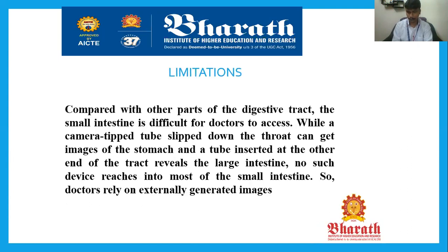Limitations. Now we are going to see the limitations of performing the endoscope. Compared with other parts of the digestive tract, the small intestine is difficult for doctors to access. You can view the internal structure of the whole digestive tract, but the small intestine, which lies in the deeper part of the human anatomy, is difficult to access or view.